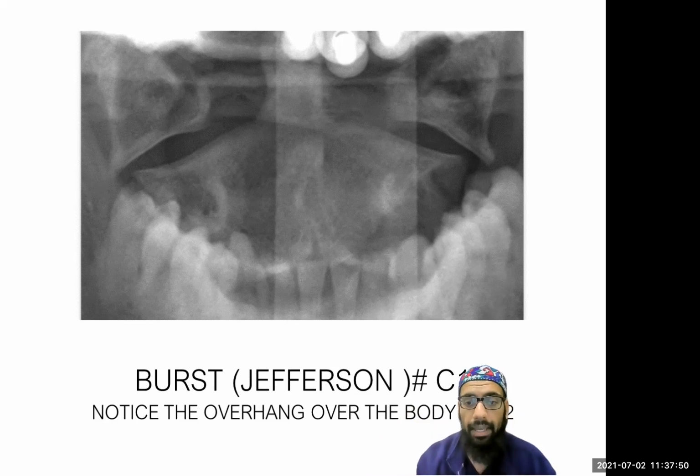further, all right? And in fact, in the emergency department, majority of the time, when you see any sort of C-spine injury, your first step is immobilize that thing with a hard collar, or at least with head blocks. Don't take your patient off the head blocks. And make sure you get a CT scan as quickly as possible.